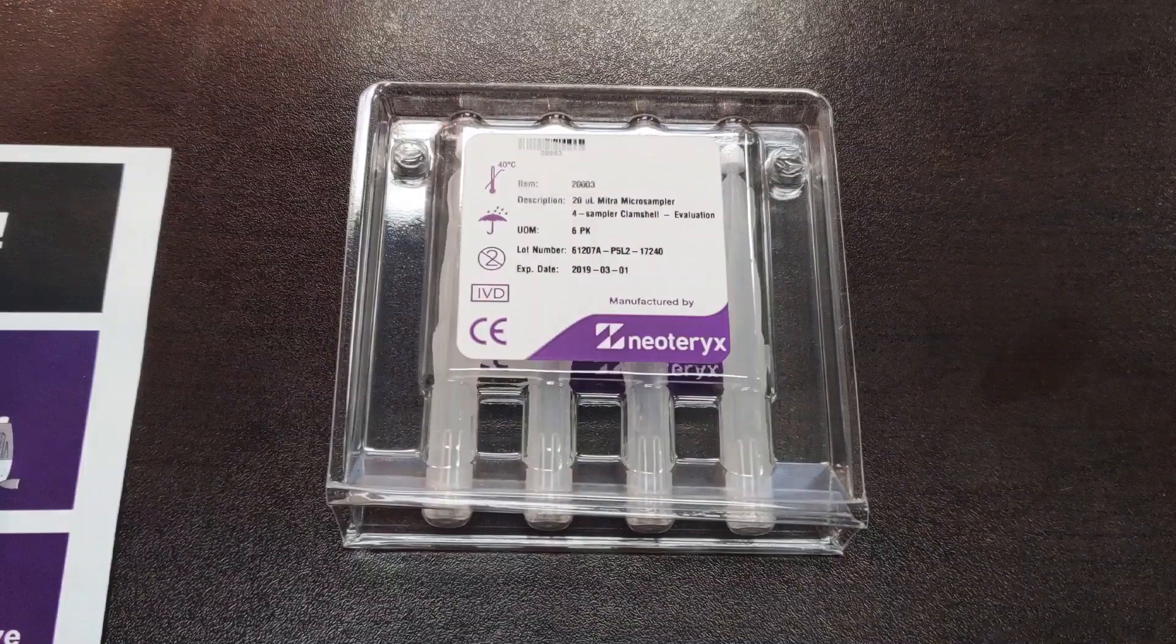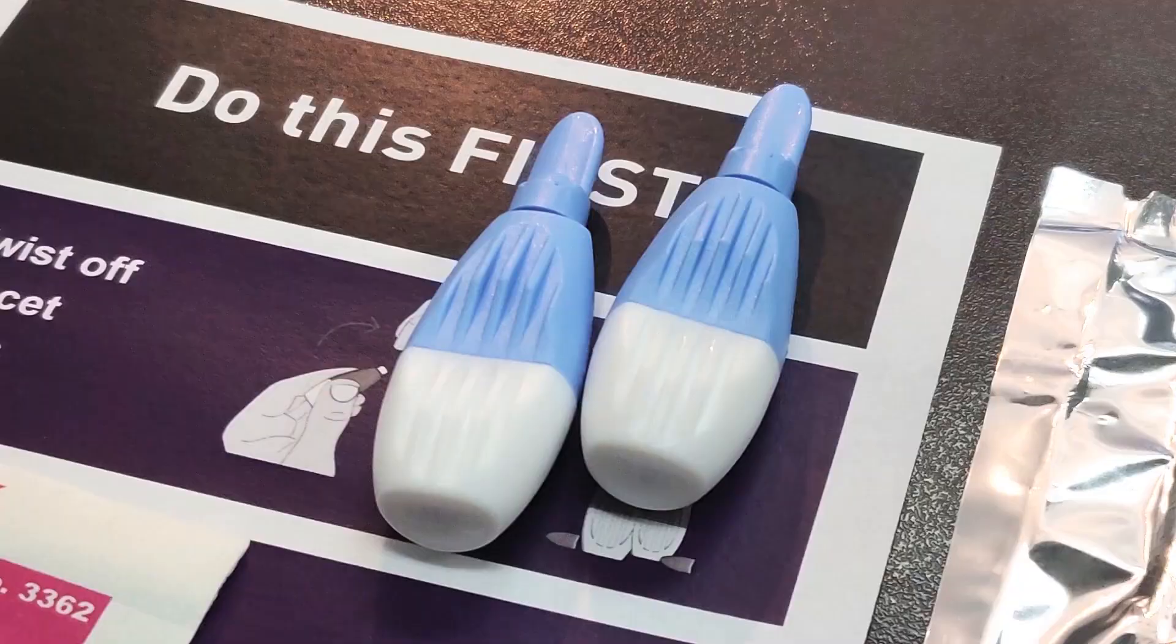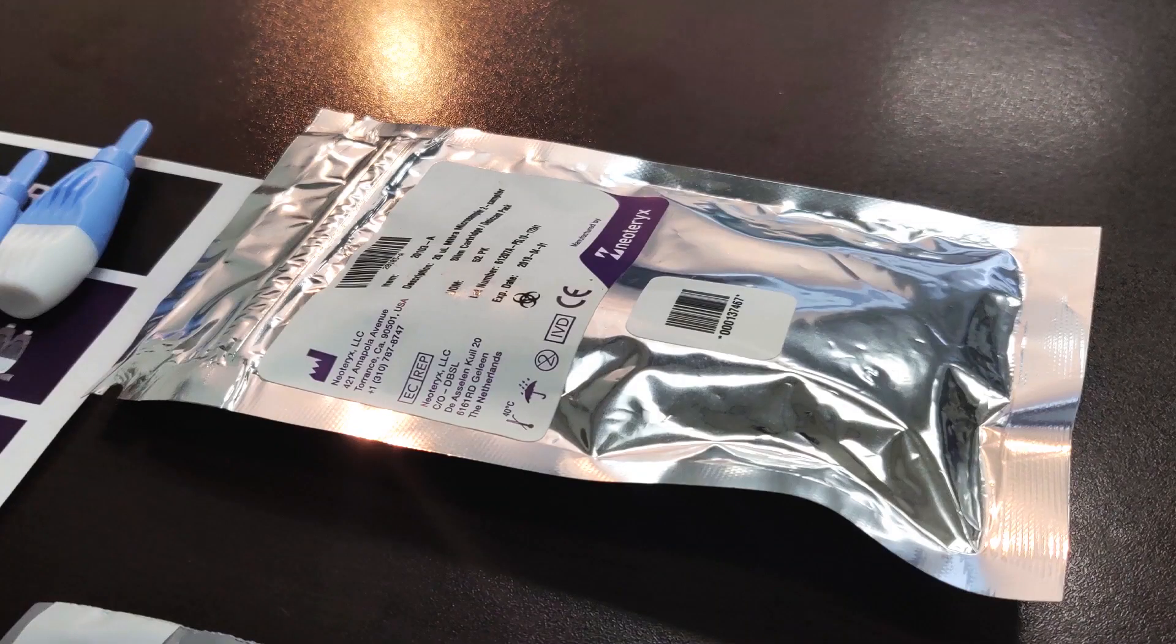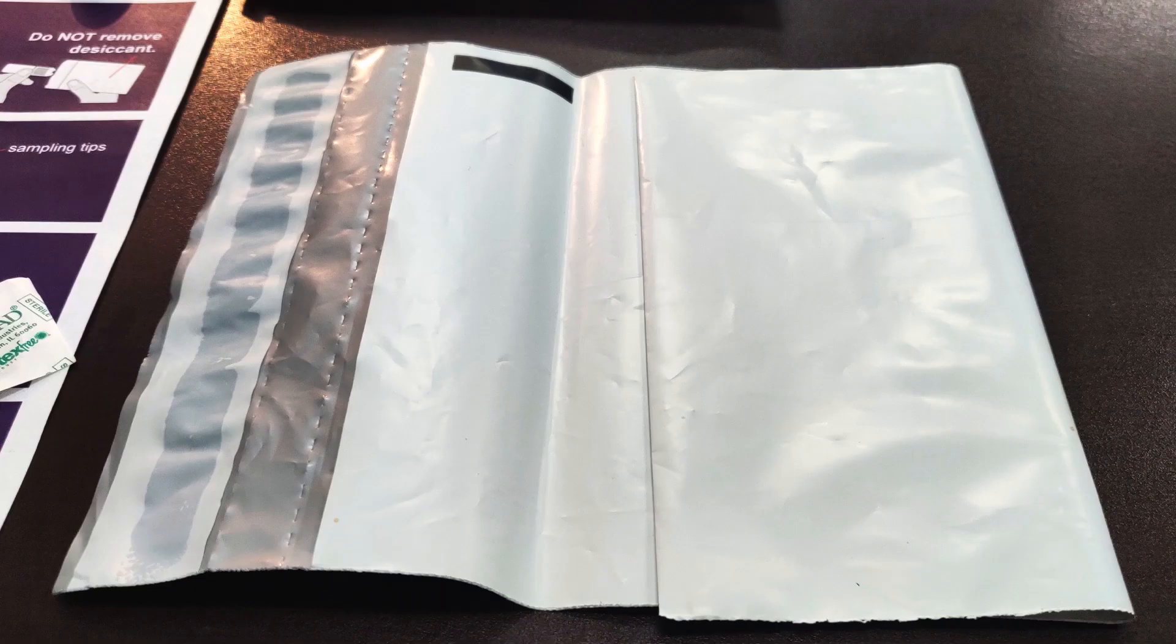The blood collection kit includes either a clamshell or cartridge style meter device configuration, lancets, specimen bag with desiccant, gauze, adhesive bandages, and a shipping envelope.